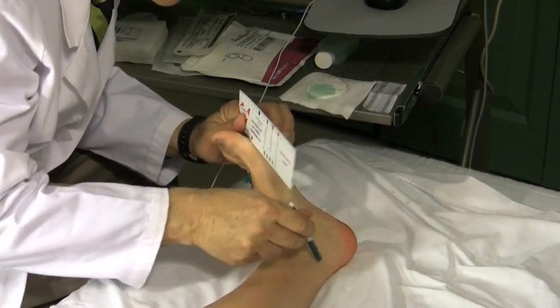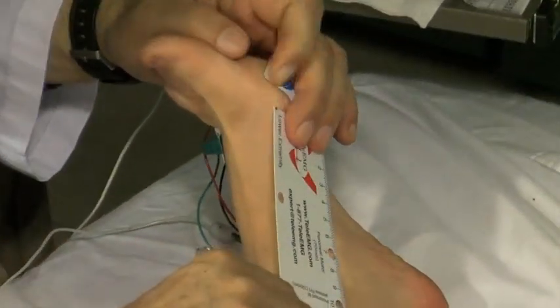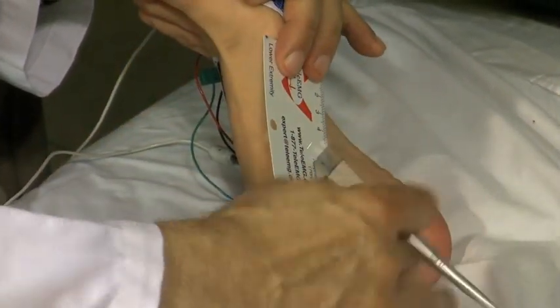And the tibial nerve I stimulate right here. So now I need to measure 14 centimeters and put that mark over there.